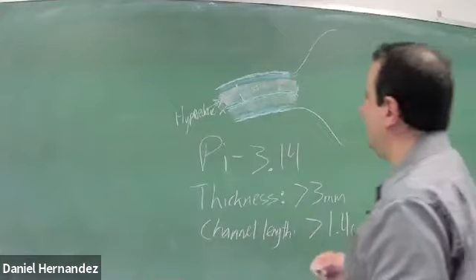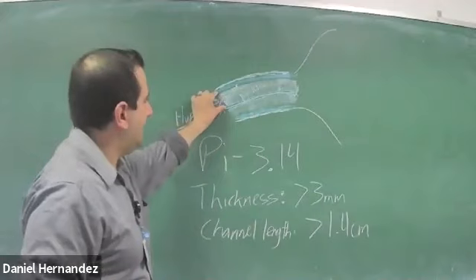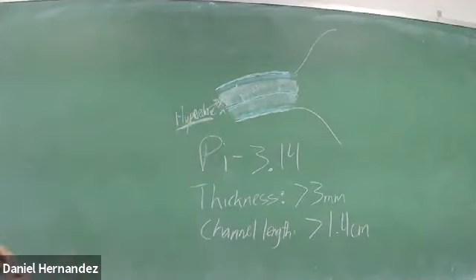So some radiologists, so we're going to measure the hypoechoic muscle thickness of that layer, that thick hypoechoic layer.